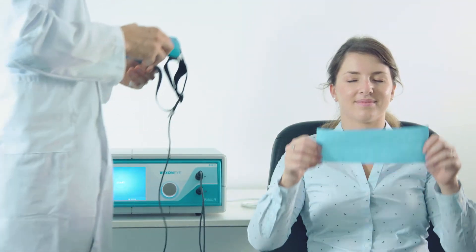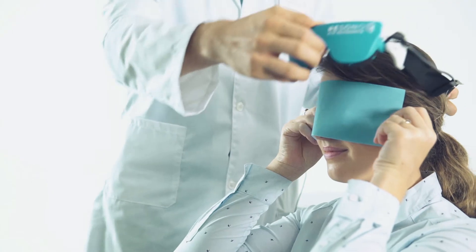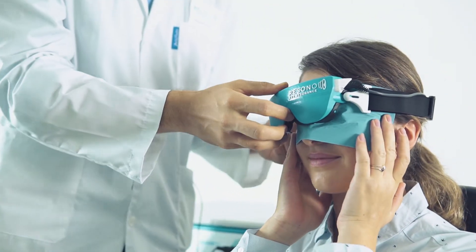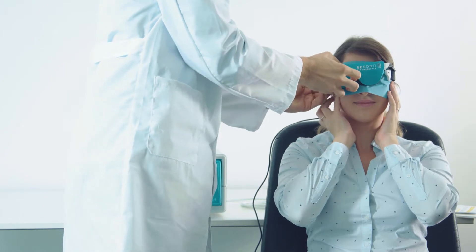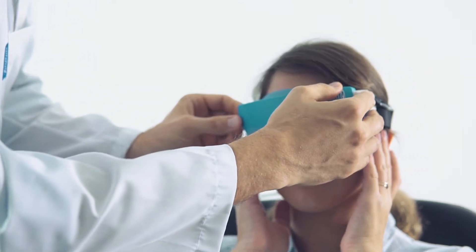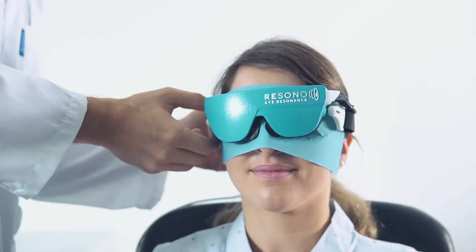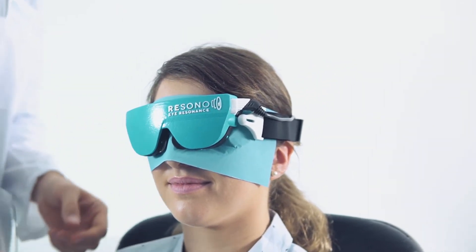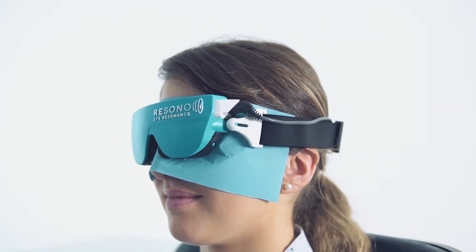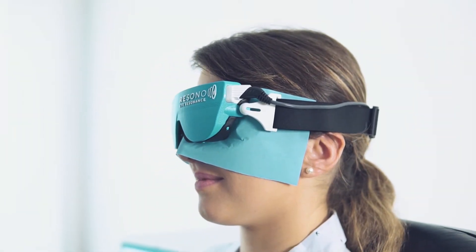After the disposable tissue has been placed on the patient, put the mask. Adjust the elastic band in order to avoid too much pressure. Ask the patient for feedback.